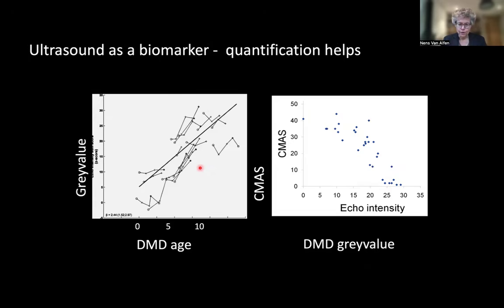So it helps to quantify your images by using that histogram gray level analysis we talked about a little bit earlier. It's a whole technique in itself. If you're interested in doing things like that, please just shout out and send me an email or something, or reach out via LinkedIn.